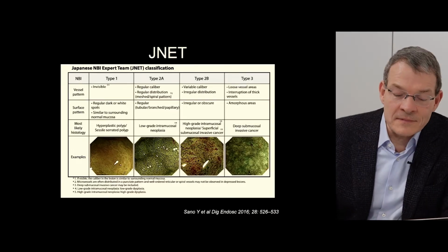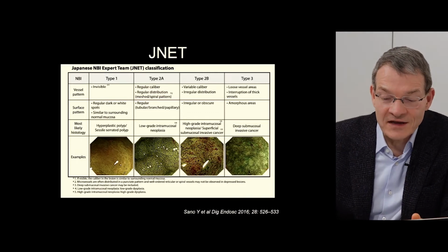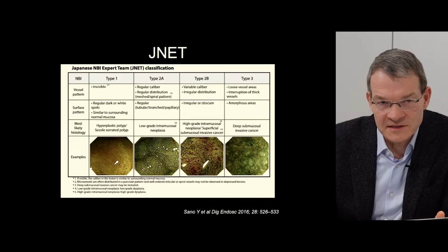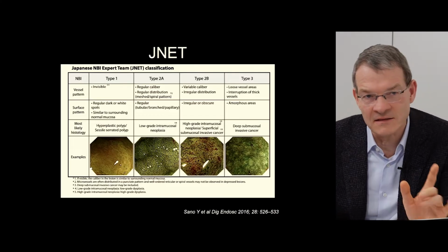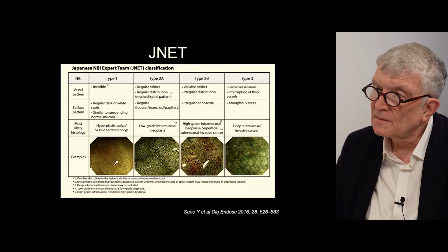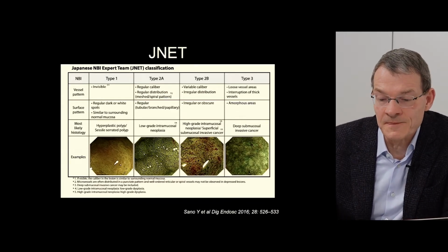I think even if it is a serrated adenoma with white light, you should definitely use NBI, because then you would notice atypical vessels, because in some serrated lesions you may also have atypical vessels, and then this is a red flag for you. Very few ones, but yes. Yes, to focus more on the endoscopic assessment.